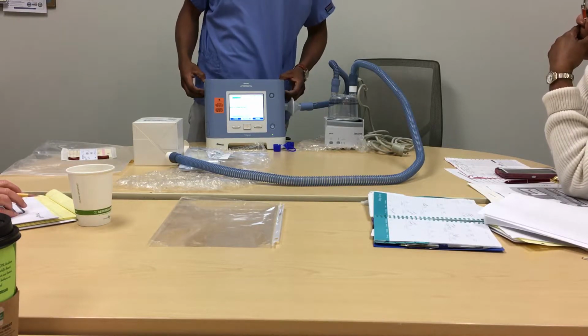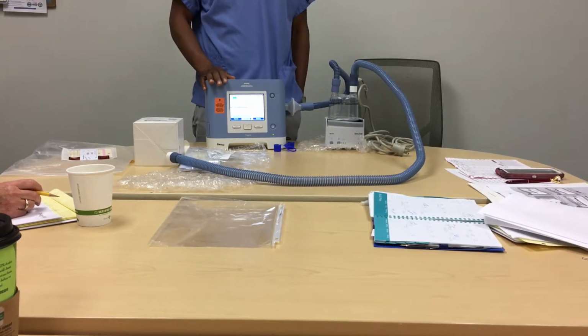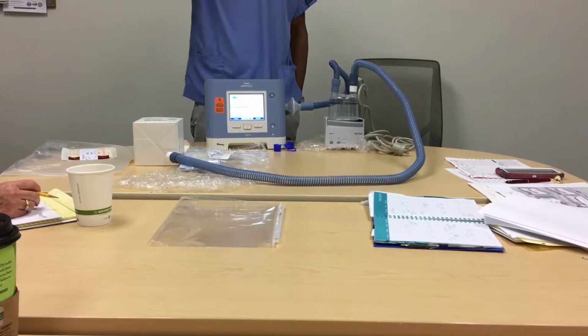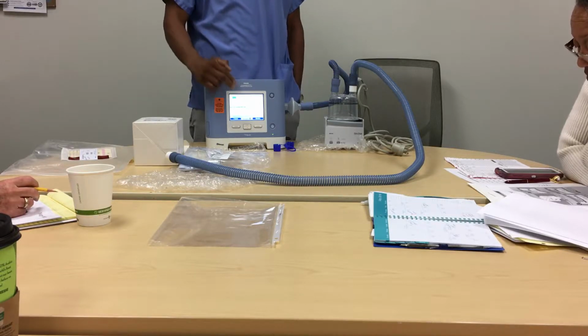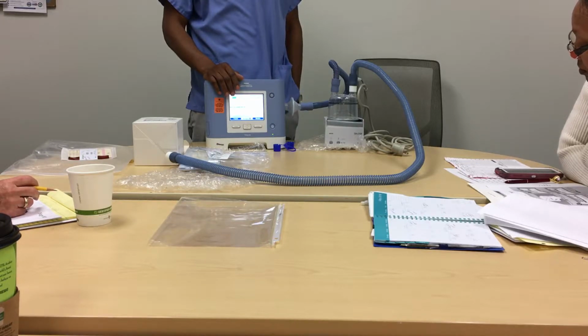What I've typically done is if I have a patient that says he feels air hungry, I'll always have to increase the max pressure in order to make those changes. I've seen patients, especially morbidly obese, go as high as 30, at times 35, just for them to get sufficient inhalatory pressures. How high can this go?